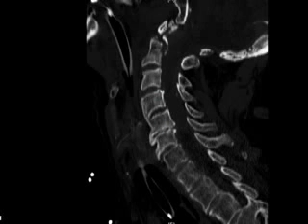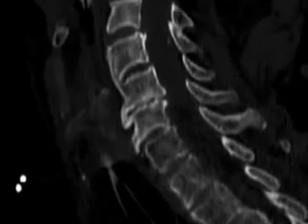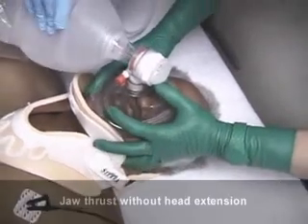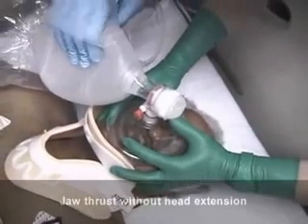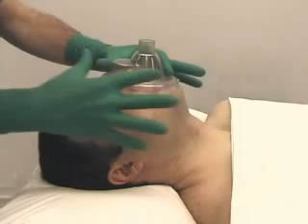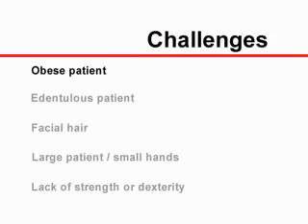Extreme caution is advised in patients with cervical spine injuries, in which flexion or extension of the neck is contraindicated. In this situation, the jaw thrust maneuver alone, without head extension, is recommended. It may be difficult or impossible to maintain an adequate seal using only one hand. This challenge can occur in obese or edentulous patients, or in those with abundant facial hair.